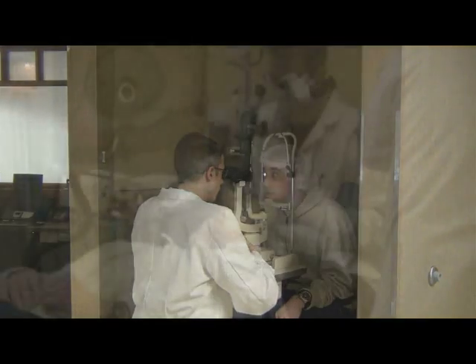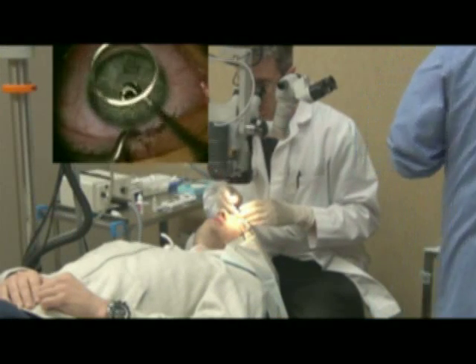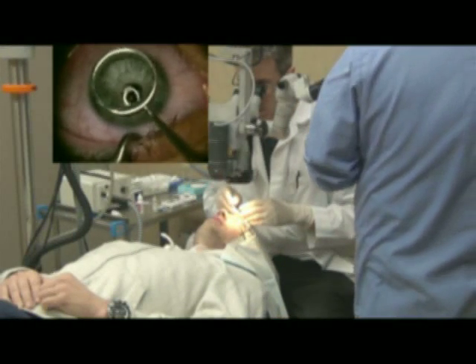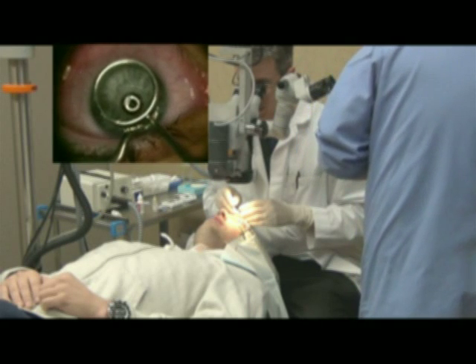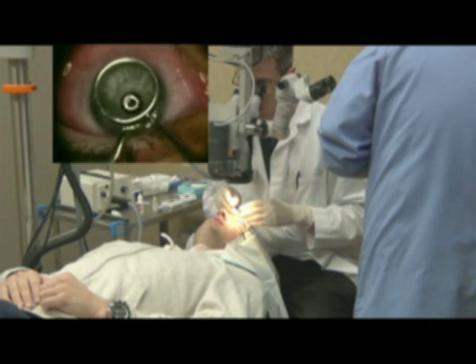We first examine the patient's eye and then, taking them into the operating room, we evaluate the eye by marking the area that we're going to treat and then checking the thickness of the cornea.